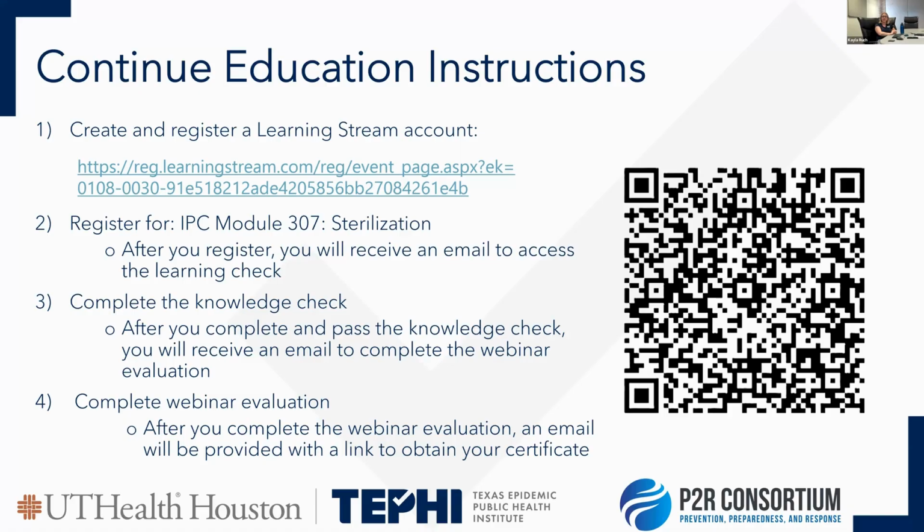Anytime you can meet before, especially if you're new to surgery, and get a standard case or something that isn't emergent, it's easier for you, especially if you're learning. You can get some IFUs. You can see what equipment they're using. They know how to process it. You can read up on the surgery they'll be performing, or you can ask your senior OR manager about certain procedures that are going on. That's another thing I would recommend if you're new to the surgery space.